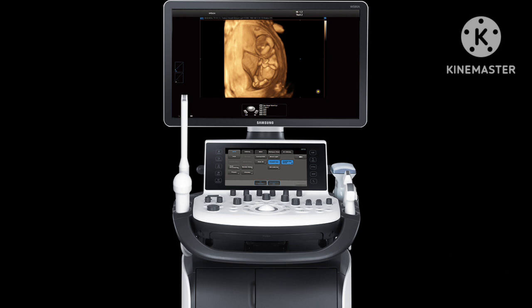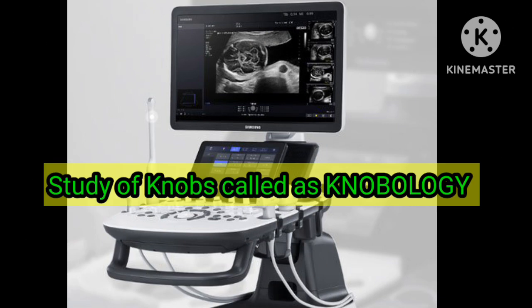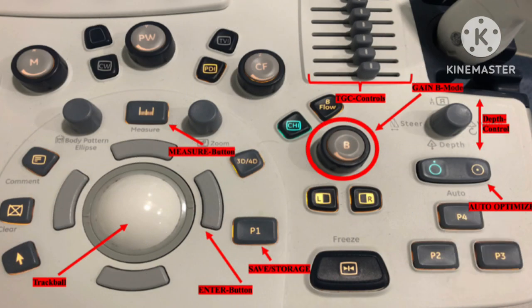Before going to sono examination, you should know at least about 10 to 20 knobs which are present on an ultrasound machine. Again I am telling, the position of each knob is not specific. You should know where the specific knob is present in your machine. The study of knobs is called knobology. Within a 10 lakhs cost ultrasound machine, 18 to 20 knobs are present. You should know only these 18 to 20 knobs which are present in every ultrasound machine.